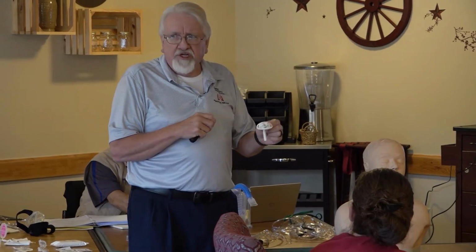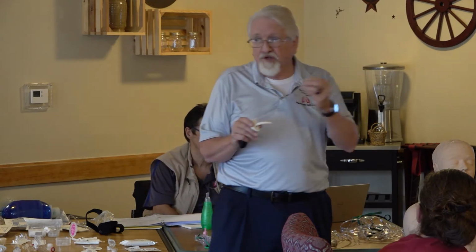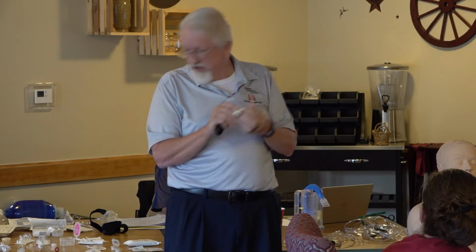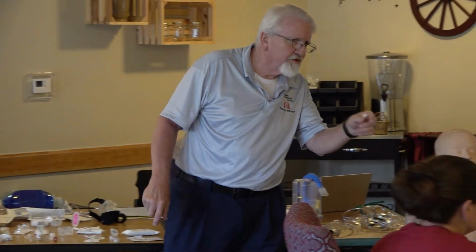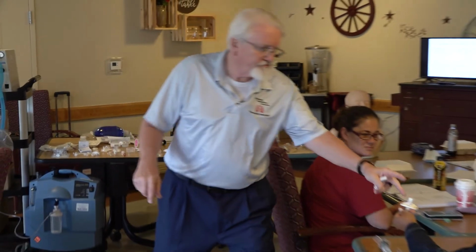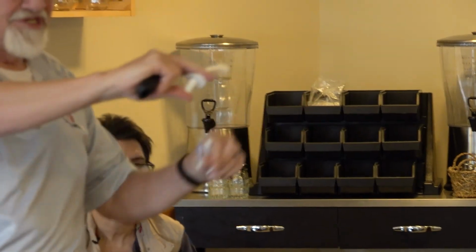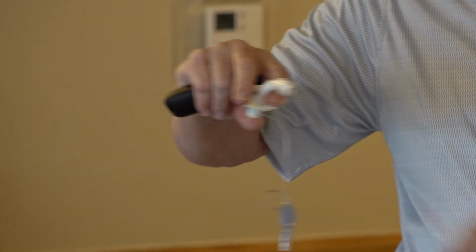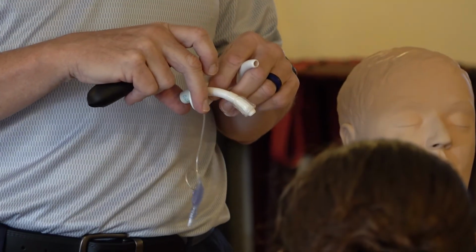The reason they usually want the initial change done in the hospital is it still has the cuff on it. So that means the stoma and all that has tried to close around the tube. Well, that one's inflated, but even with this cuff deflated all the way, look at all that extra that's there. And remember now, the stoma has grown to the tube. So that means when I pull out, I'm pulling all this stuff too. And like I said, I've seen them get very nasty. That's why they usually do them in the hospital, not here.